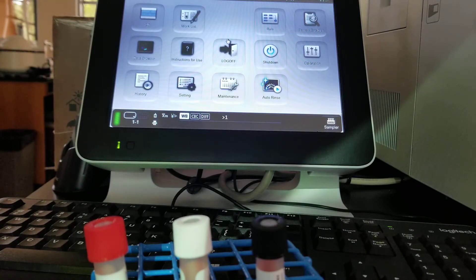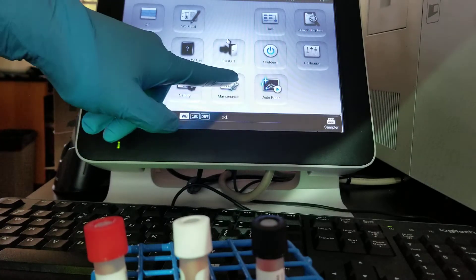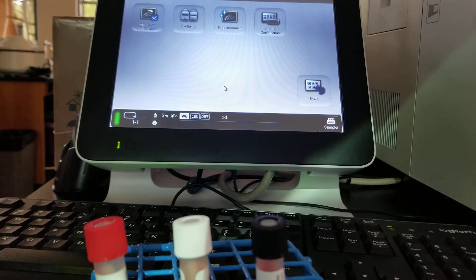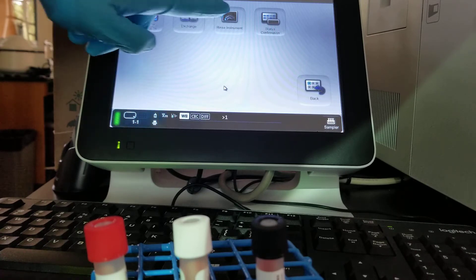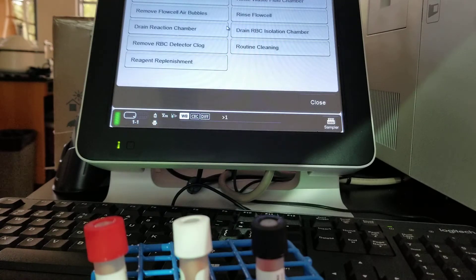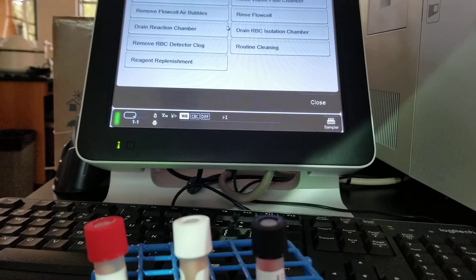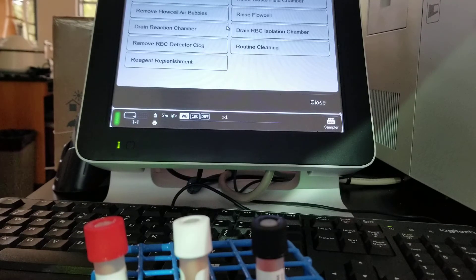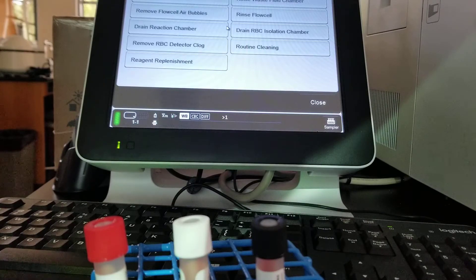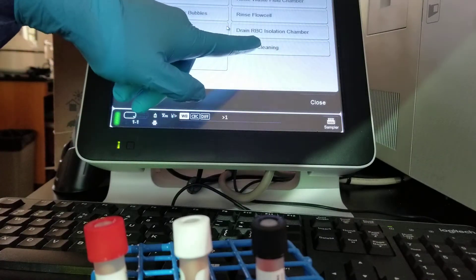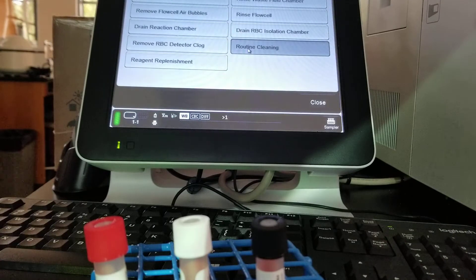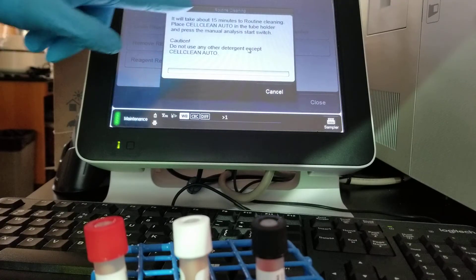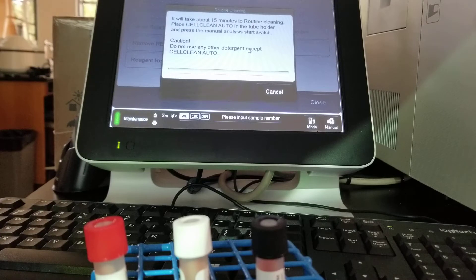What I'm going to do is touch the maintenance menu. And then we're going to touch the rinse instrument. Now it gives us a whole list of things that we can do. What we're going to do is touch the routine cleaning. That's the last one right here. So we're going to touch routine cleaning. Now it's going to tell us what to do. It's saying it's going to take 15 minutes.